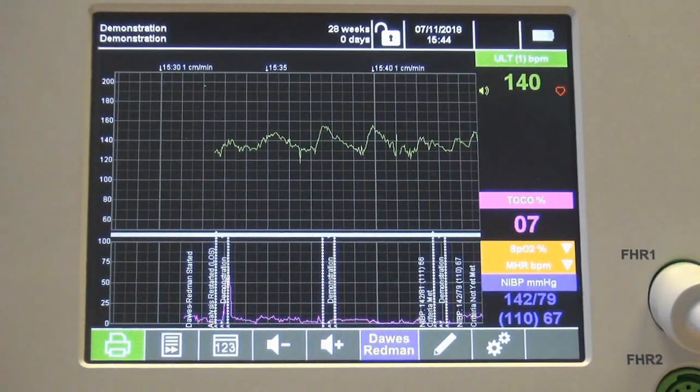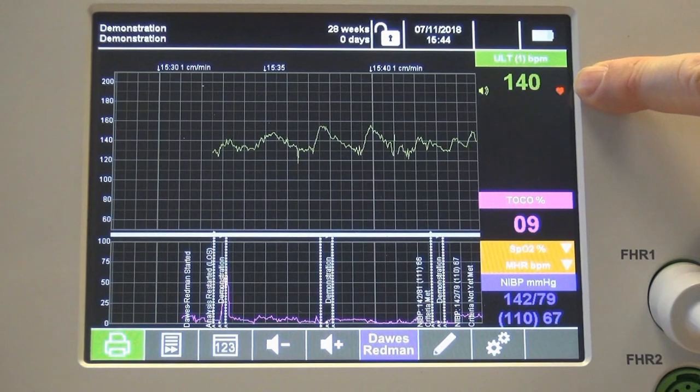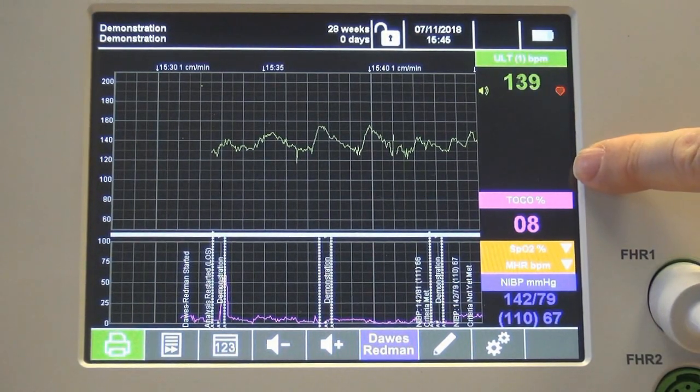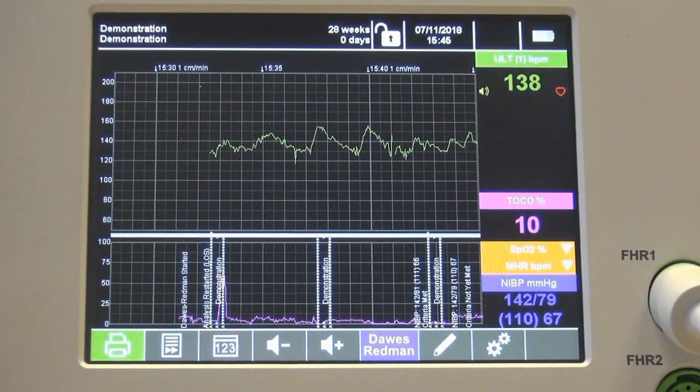Enter the trace screen by clicking the function button. Along the right side of the screen you will see the heart rate value. If twins or triplets are being monitored, you will see their individual colour-coded heart rates. The contractions value can also be seen.